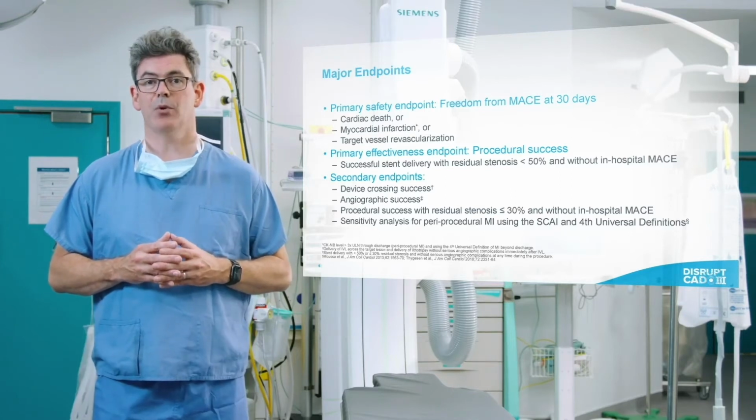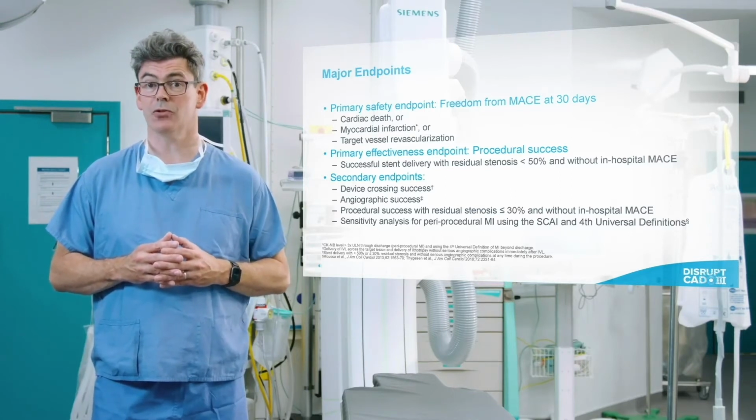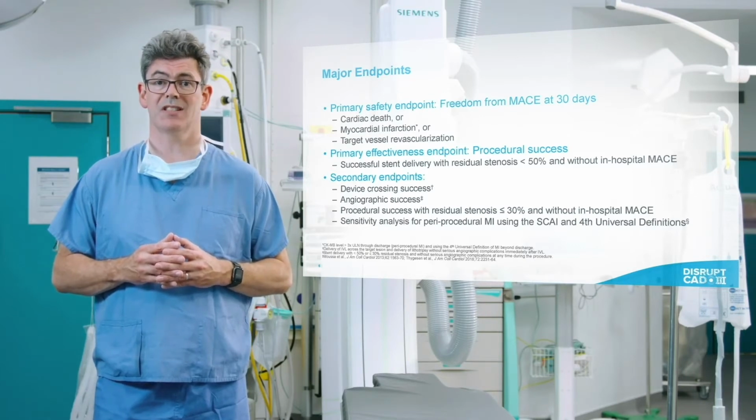Key secondary endpoints are shown and include procedural success with a residual stenosis less than or equal to 30% and no in-hospital MACE, to allow a sensitivity analysis with a more contemporary definition.